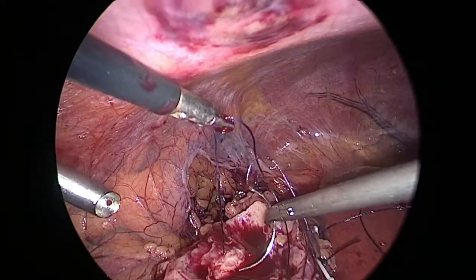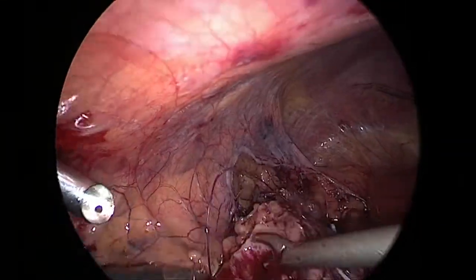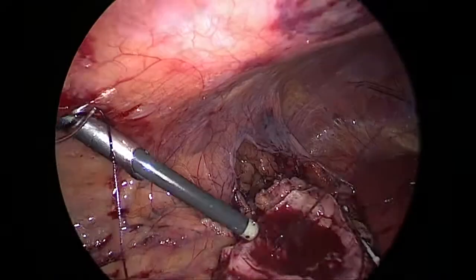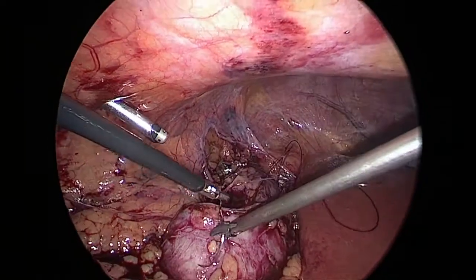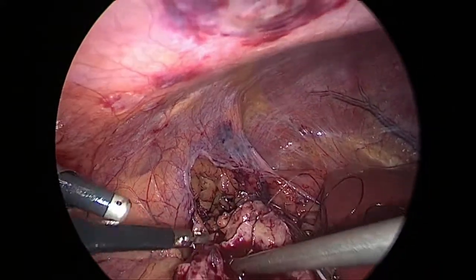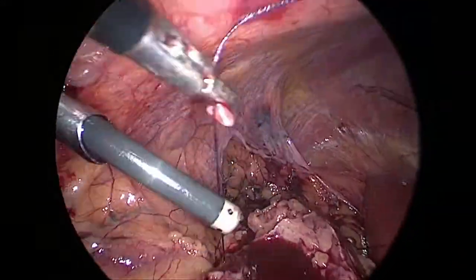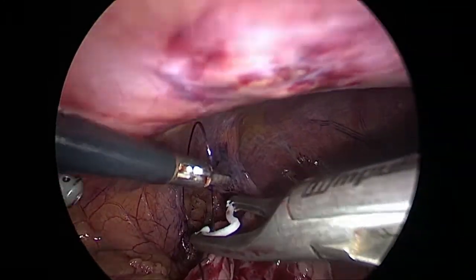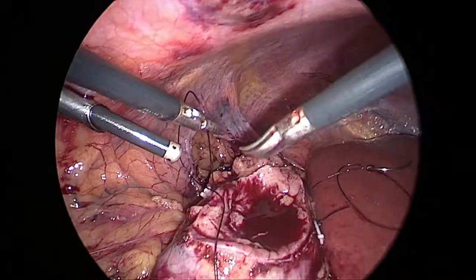So I am overrunning the area with 2-0 Vicryl, and that is the first layer of renorrhaphy. Our total ischemia time was less than 30 minutes, almost 30 minutes.